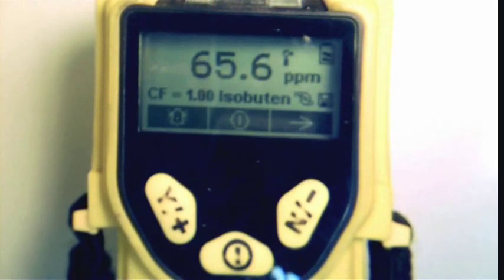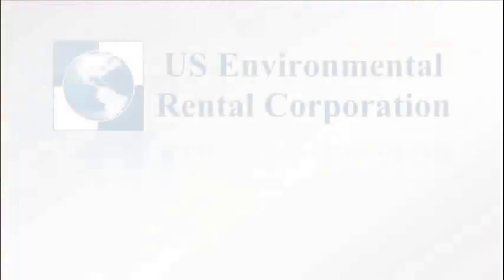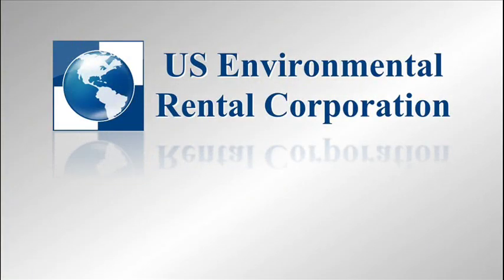After a moment, disconnect the Tedlar bag and make sure the readings drop to an acceptable reading close to zero. This completes the calibration of the MiniRay 3000. Remember, if you have any questions regarding this or any other project, a knowledgeable and experienced U.S. Environmental Associate is ready to assist you.